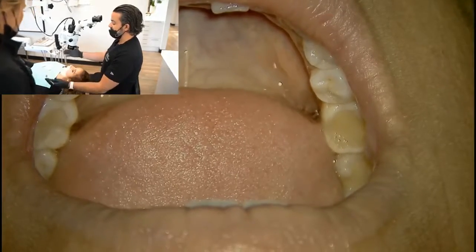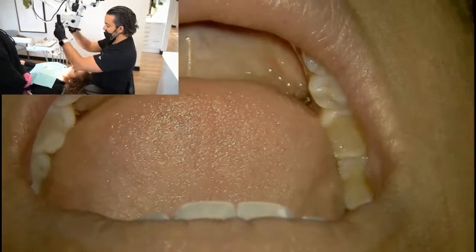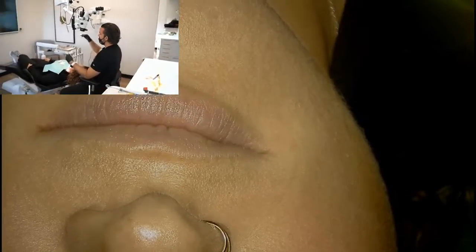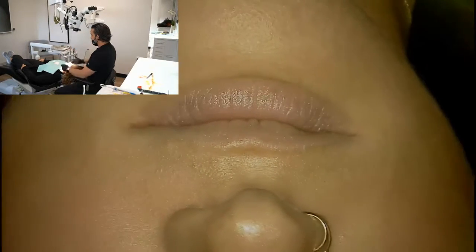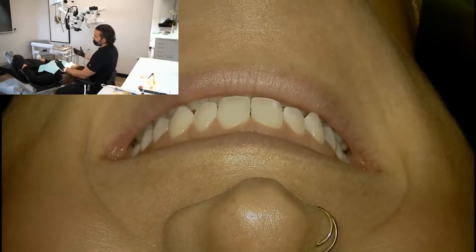in general dentistry, you actually want depth of field and you want sort of position. If I go up farther, can you see this whole distance? If you look at my screen, I'll get this in focus. I'm not a giant. I'm 5'9". I'm not a basketball player. But when you have longer distance, you get a bigger working field. And so I'm basically seeing her entire face here. Smile. There you go. And it's easier to stay in focus.